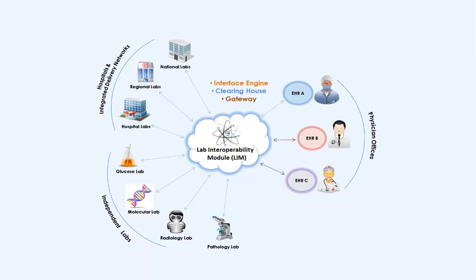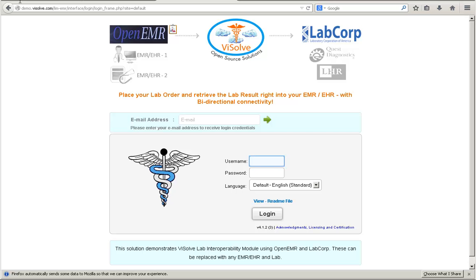Let us consider a scenario for this demo. Dr. Lisa Thomas is a physician who wants to place a lab order to LabCorp for one of her patients. Dr. Lisa uses OpenEMR at her facility that is integrated with Vsolve Lab Interoperability Module.